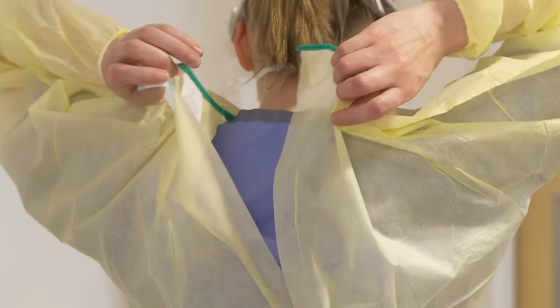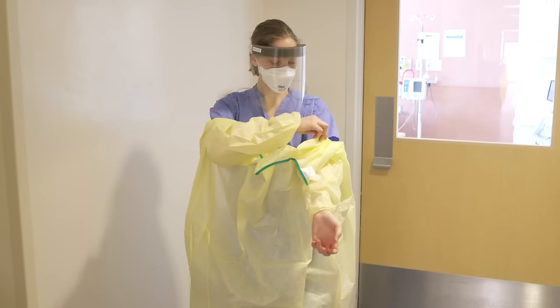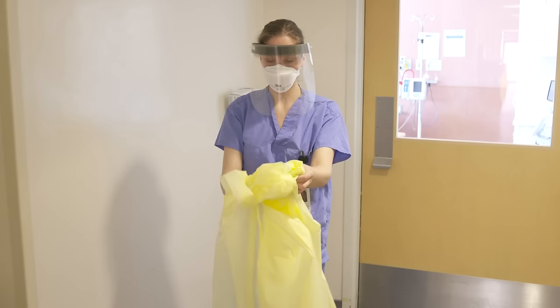Remove your gown by first opening at the neck and then at the waist. From the back of the neck, take the gown and slowly pull it out and away from you. Ensure you are only touching the inside of the gown as you roll it into a ball, then throw into the garbage.